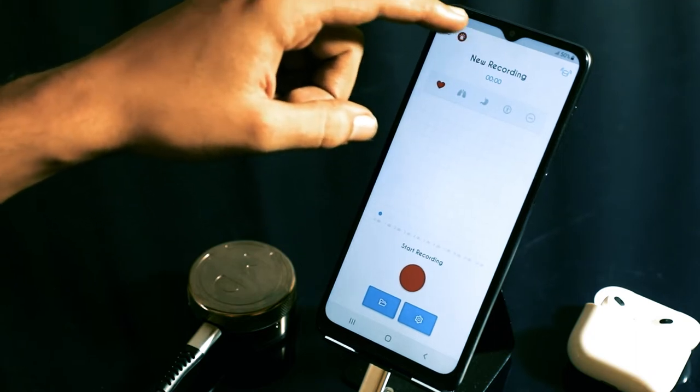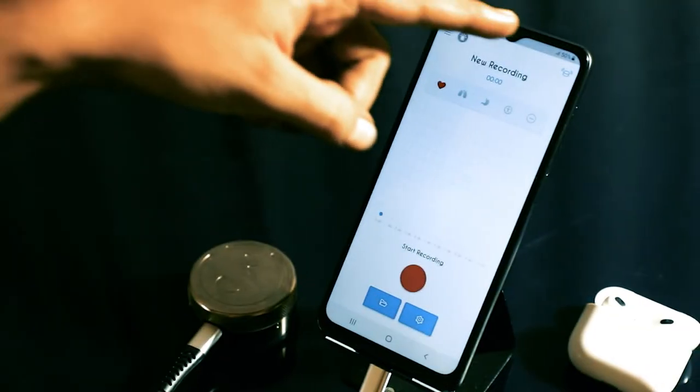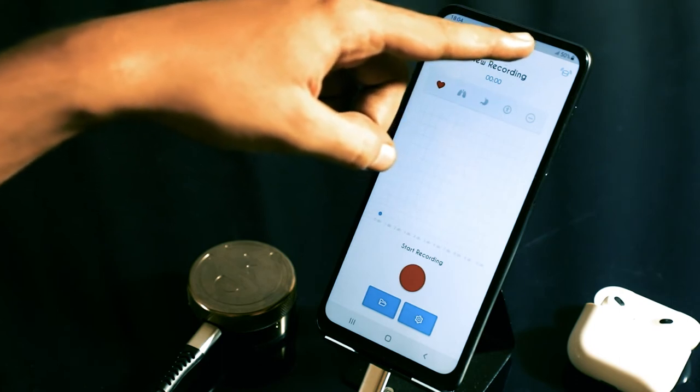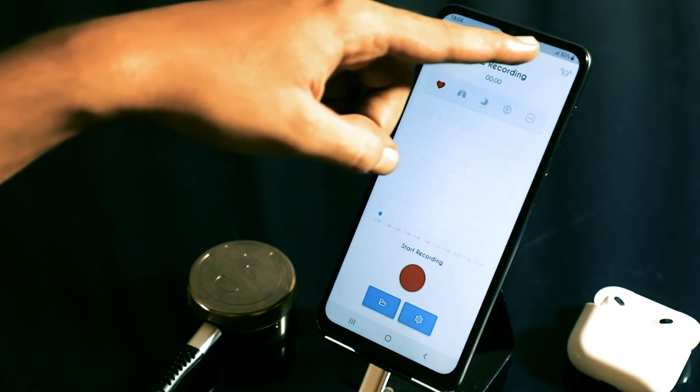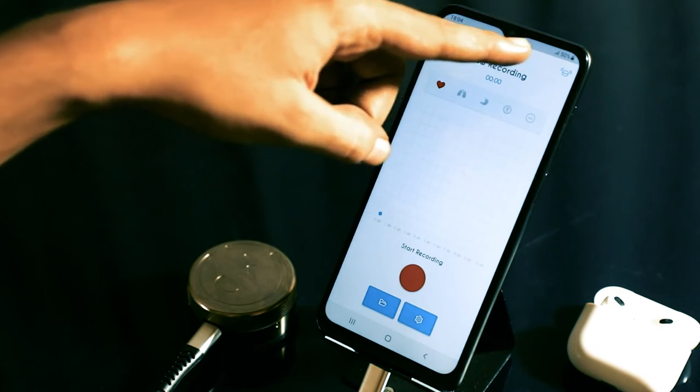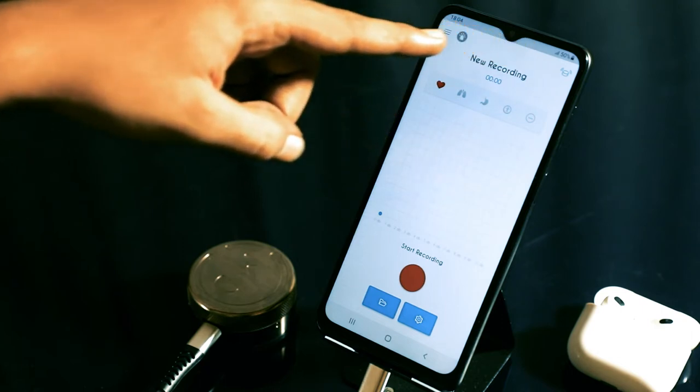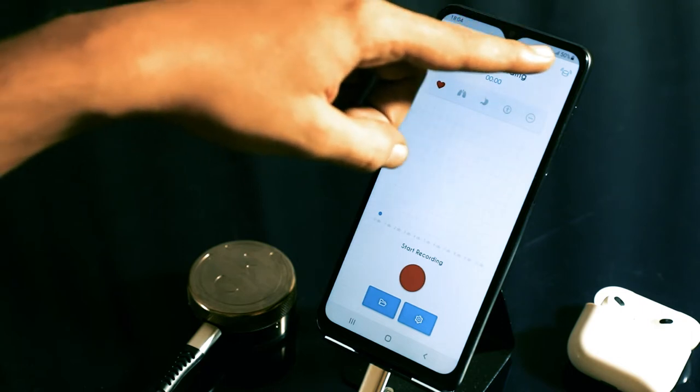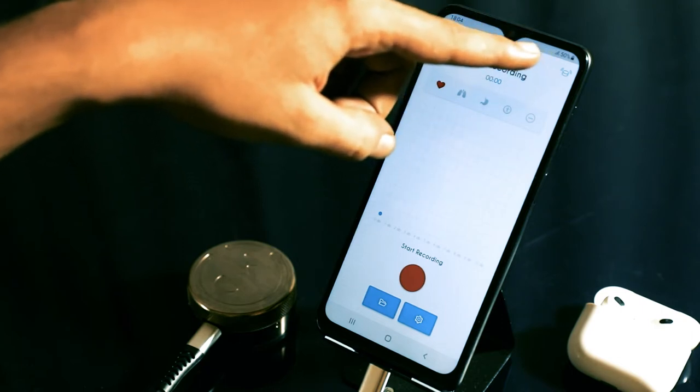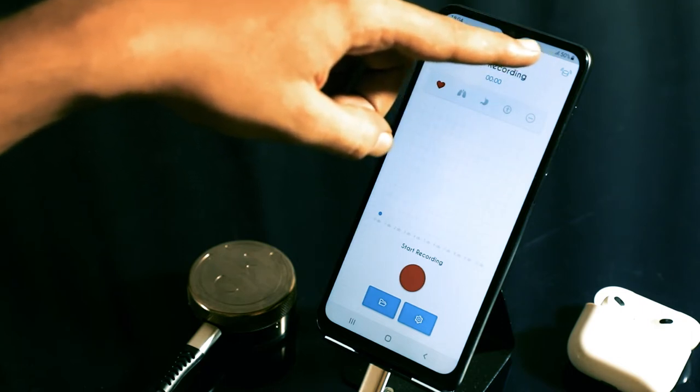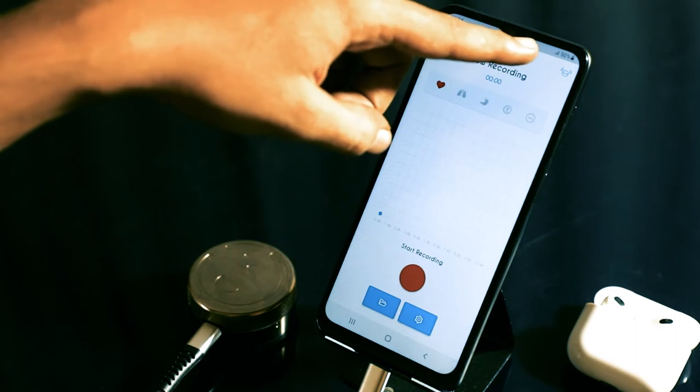The other icon on the other side of the screen is the device status indicator. It lets you know if your device is connected or not. If it is connected, it will be blue. If it isn't, it's going to be red.